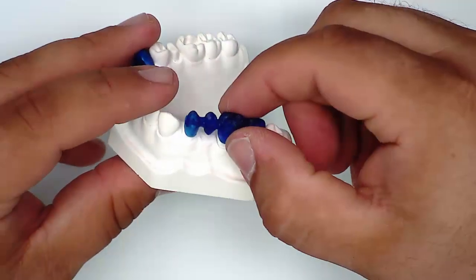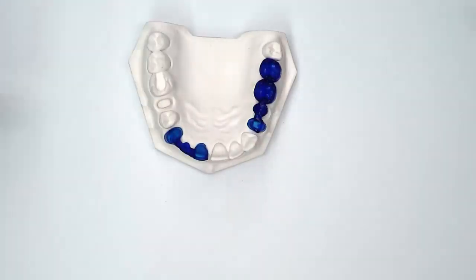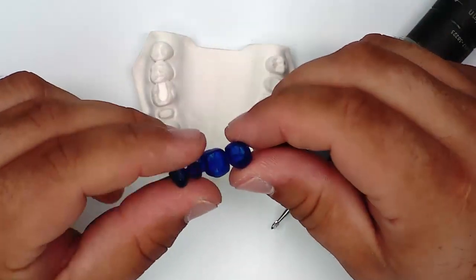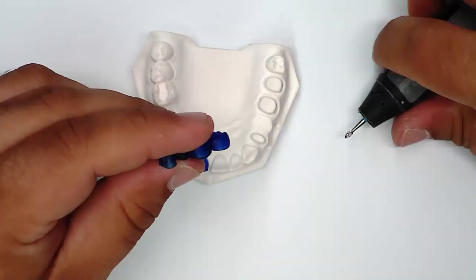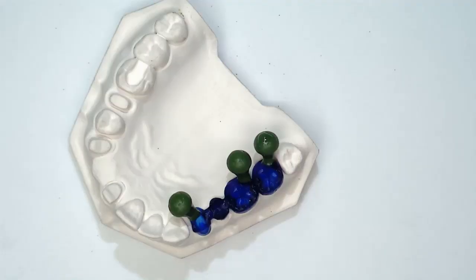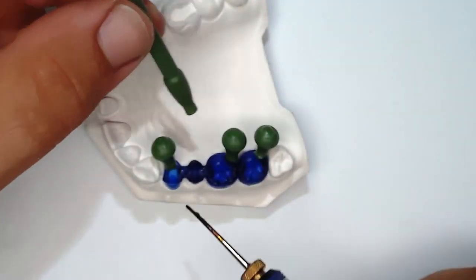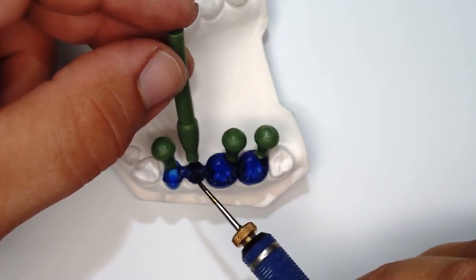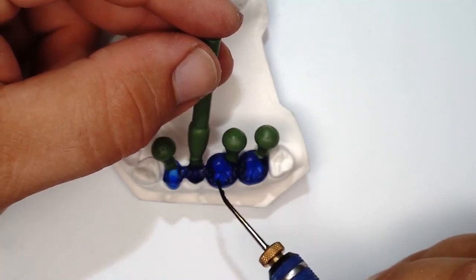Then, for example, you can check whether the preparation margins were defined correctly. Otherwise, the objects will be modified. This can be easily achieved due to the excellent grindability of the V-print cast. Now the attachment is done with casting reservoirs. Here we will show the attachment of the casting channel. The casting reservoirs prevent the formation of holes in the cast objects.